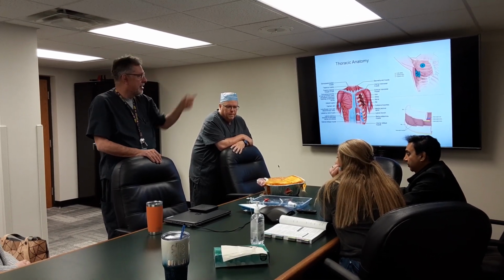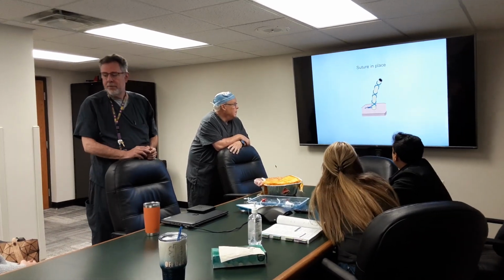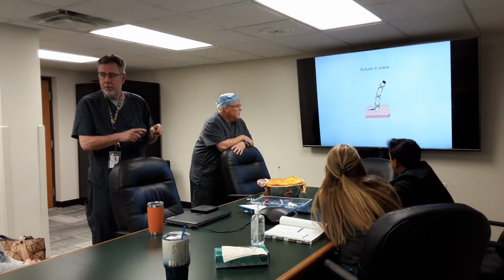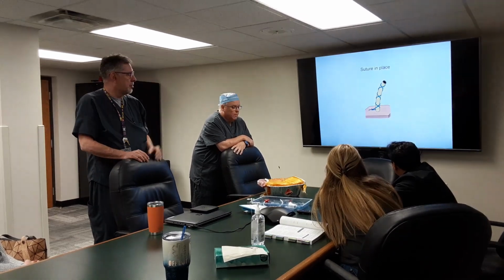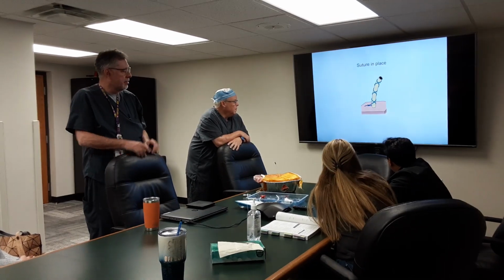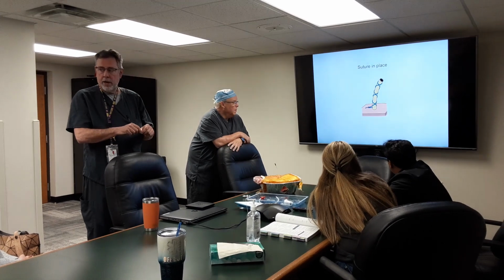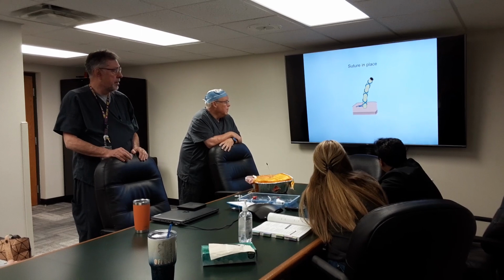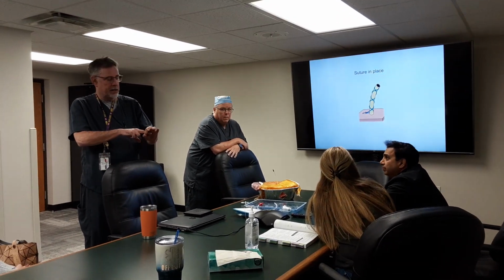All right, so next. There we go, so that's the Chinese finger trap. That's where you're going to suture this into place. Notice it has about three, it's not real tight, right? The whole idea is that you want it a little bit loose, so you suture it to the skin, take a healthy bite, then tie that down, then you're going to have two ends, and those two ends you're going to wrap around three different times, and then tie it up above that. So the whole idea is it's loose enough that as it pulls back, it's being held in place.